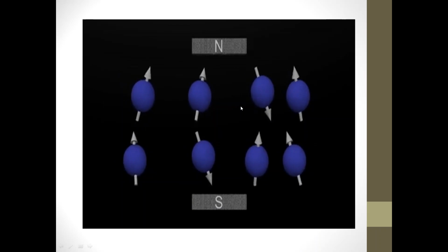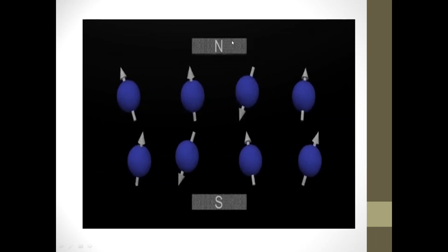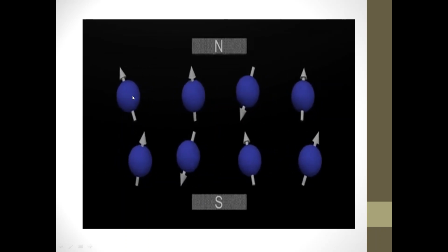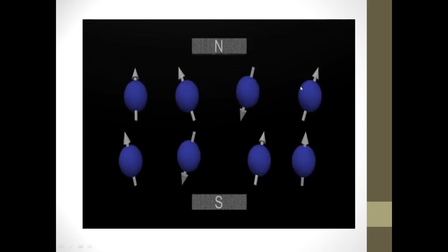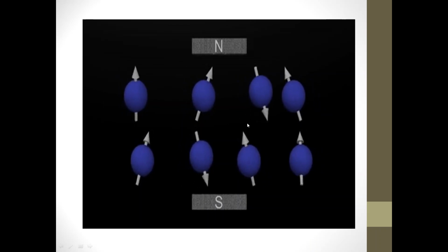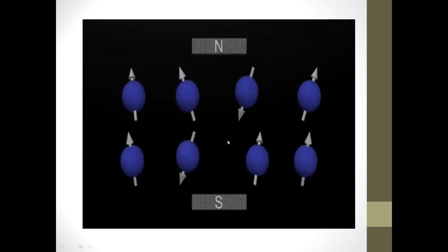This is very important information, because each proton here acts like a tiny magnet. Each one has a magnetic property, adding magnetization to the net magnetic field.